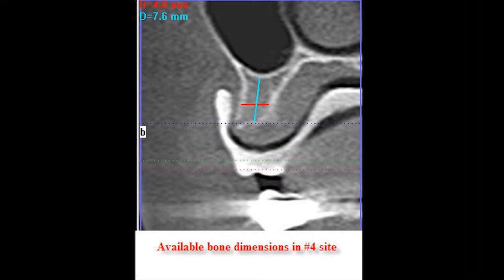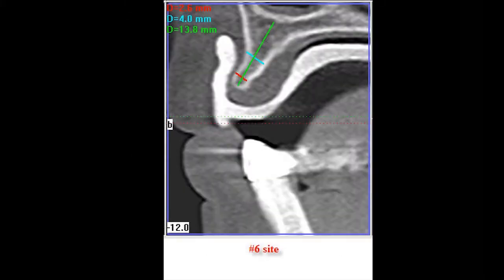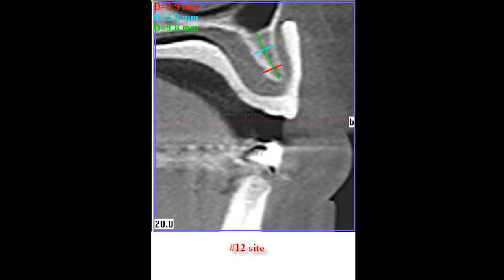So the foresight, like I said, is pretty good. We know that we've got 4.8 width, 7.6 height. So we're just going through and measuring all these areas. Get to number 6. It's 2.6 right here, 4.0. I'm thinking about bone spreading, this deal right here. Because the options are go in and try to graft all of that. Then she's wearing a denture. It's kind of a big job. And so I'm really thinking about doing a real nice job of bone spreading in all these areas because the cortices are apart.